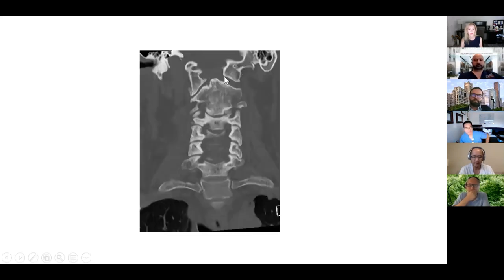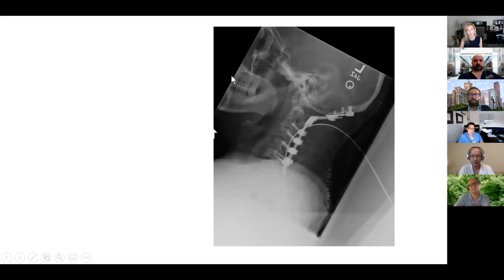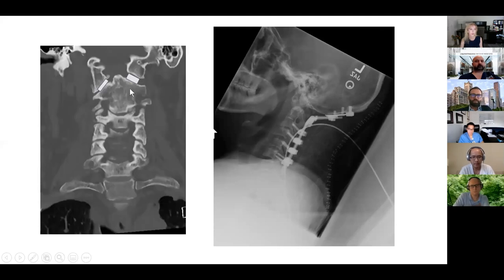So that's how it looked. That's the coronal view. You can see the joints are distracted, not equally, but they were distracted. And then you do this OC fusion. You can't put screws into C1, C2. I mean, C1 is non-existent, so it's occipitalized. C2 and C3, there's no normal bony anatomy, but you can put screws there. So I went a little bit bigger, maybe a level extra. And you can put shims or a bone graft in the distracted joints to help with the fusion and also to help prevent recurrence, because they can resettle. If you do that, it would decrease the incidence of resettling. And he had an excellent outcome, this person, too.